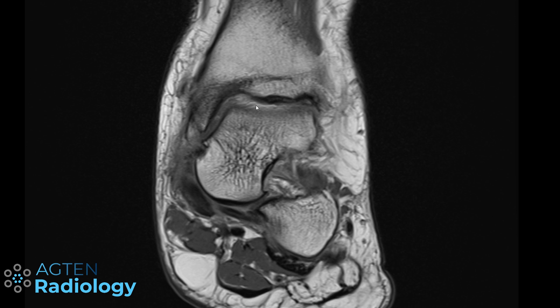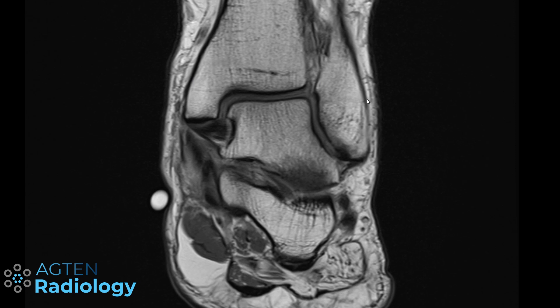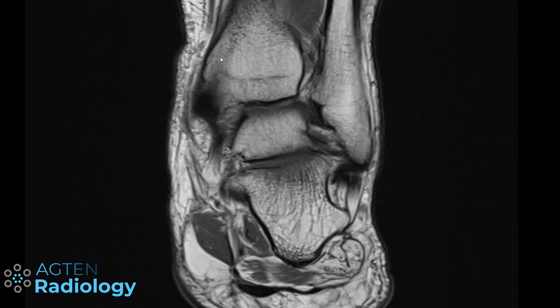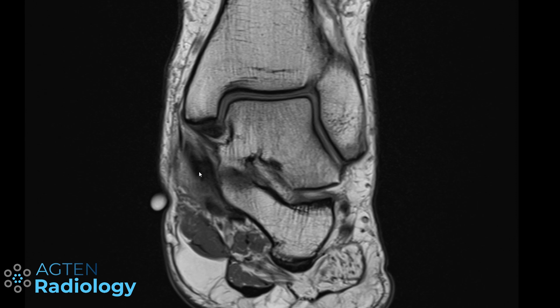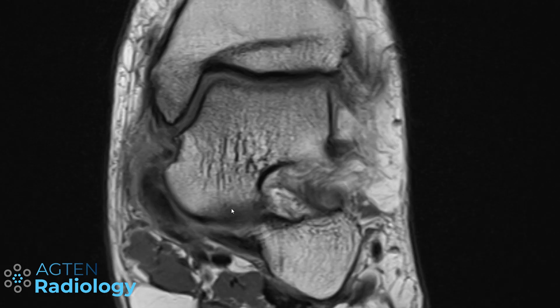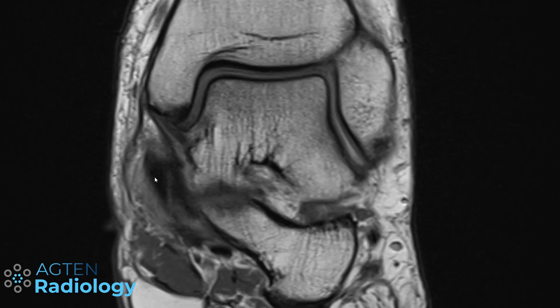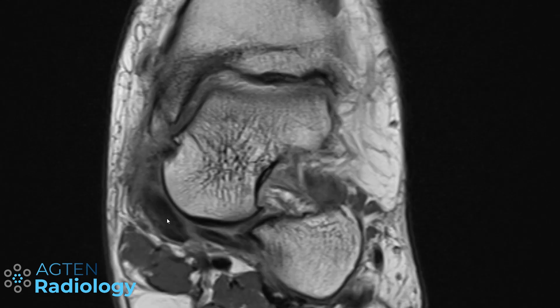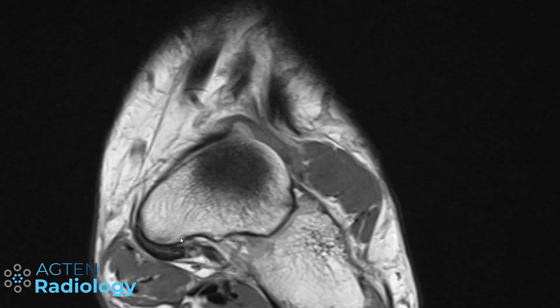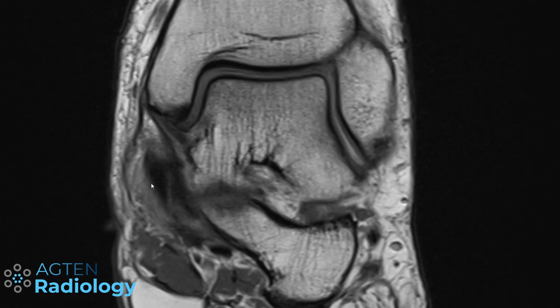The trick I want to show you today is: take a coronal sequence of the ankle joint and go to the posterior tibial tendon — you can see the posterior tibial tendon here — and then identify the talar head. You identify both structures, follow the posterior tibial tendon all the way down, and you can see it inserting into the navicular bone with additional insertions on the plantar side of the foot.